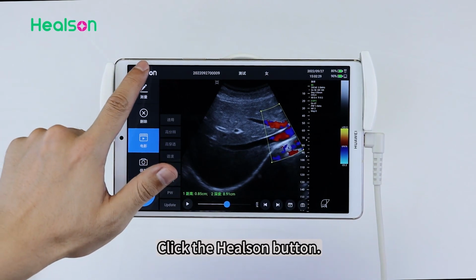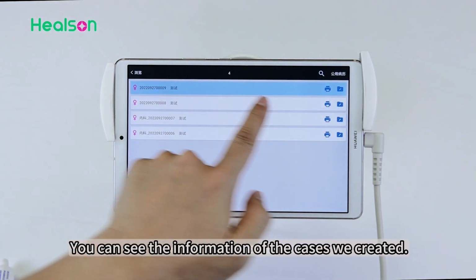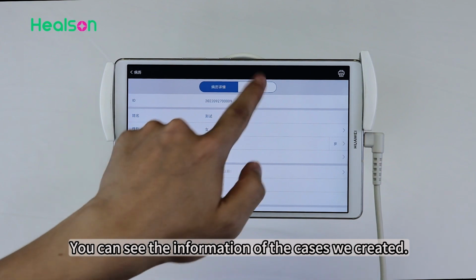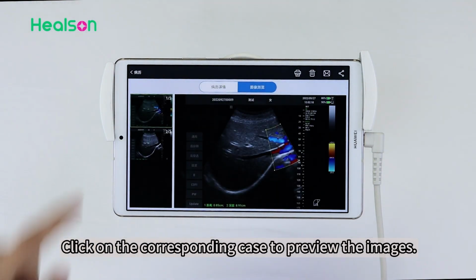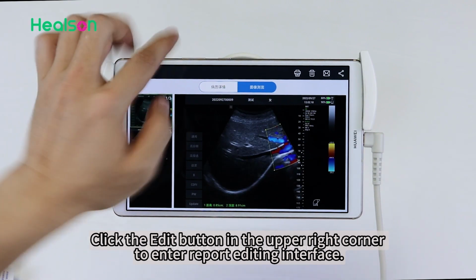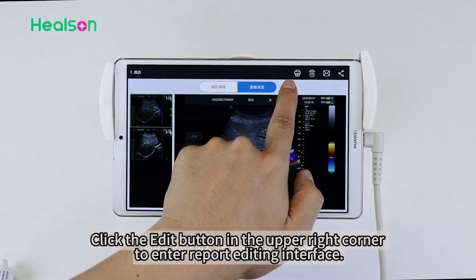Click the Healson button. Click Review. You can see the information of the cases we created. Click on the corresponding case to preview the images. Support zoom preview. Click the Edit button in the upper right corner to enter report editing interface.